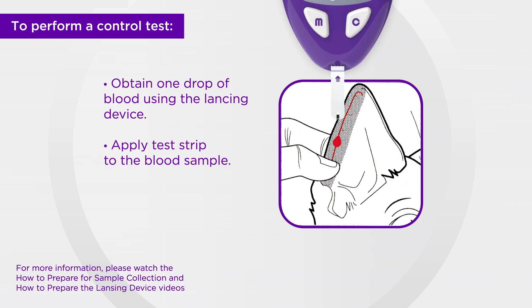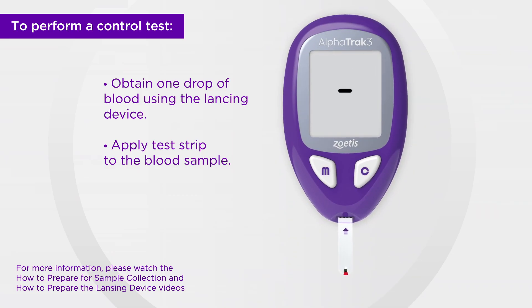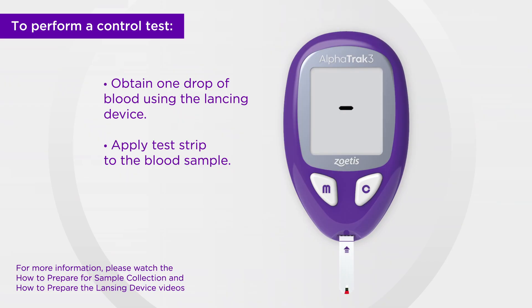Touch the blood droplet with the front edge of the test strip until you hear a beep and a horizontal line appears on the screen. The meter will count down from three and results will appear within seconds.